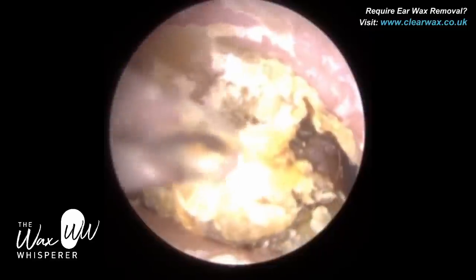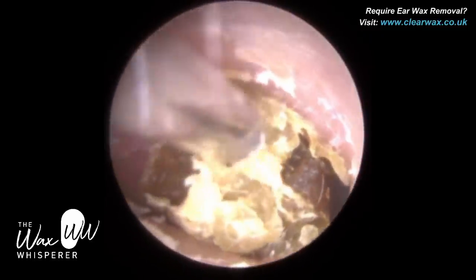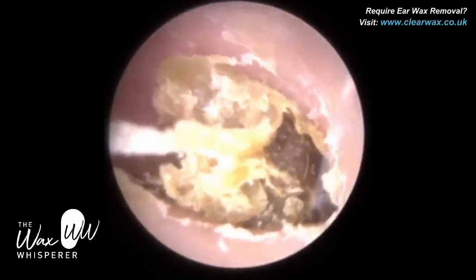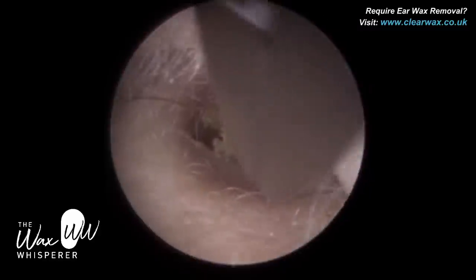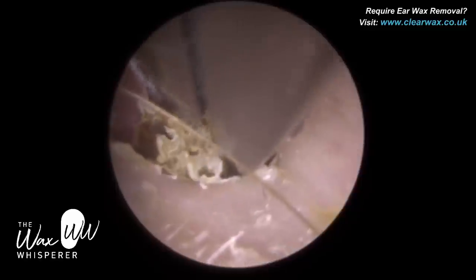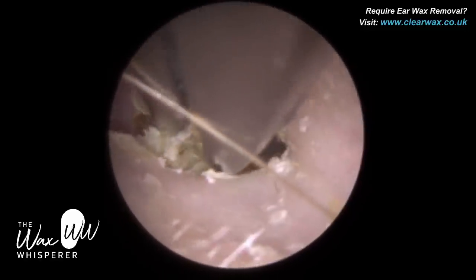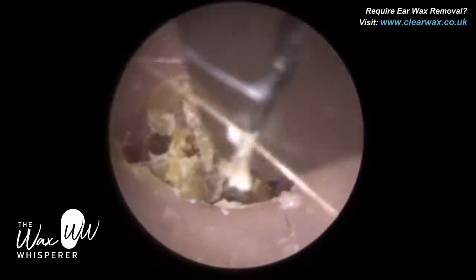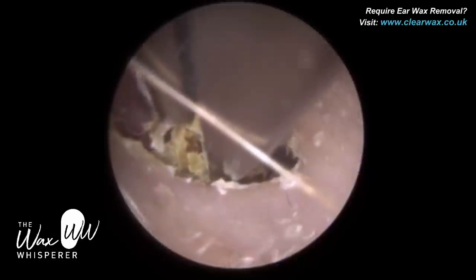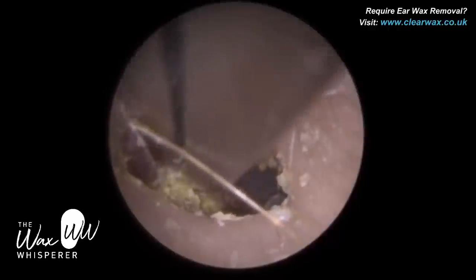In a moment I'm going to revert to the crocodile forceps. This gives you some perspective of how narrow the patient's ear canal is — the forceps are almost completely occluding, blocking the entire ear canal. If you see some of my other videos on the crocodile forceps removal playlist, you'll see that even with the crocodiles in the ear there's still a lot of the ear canal visible. Here the crocodiles are almost completely occluding the view, which gives you some perspective of how narrow this canal is.